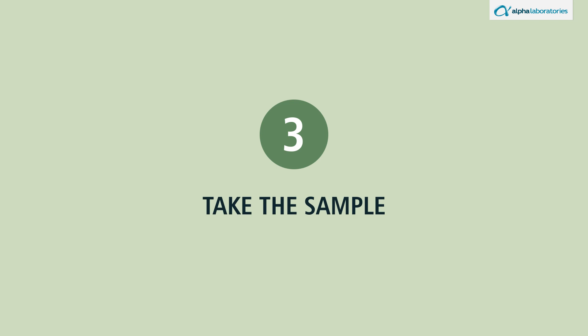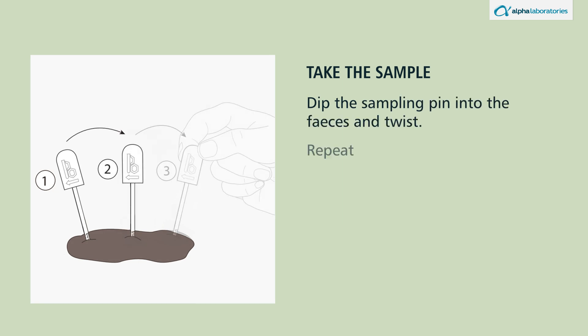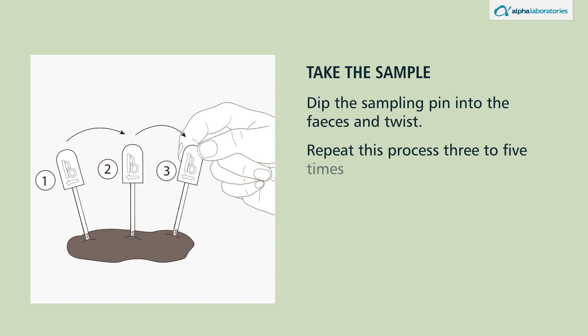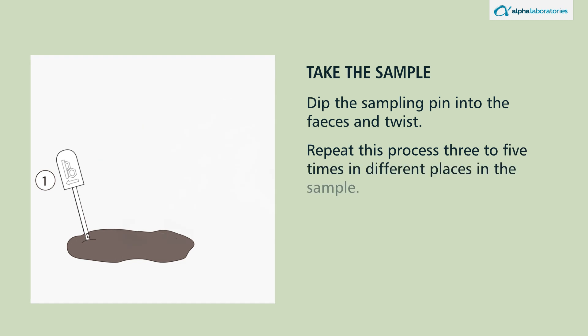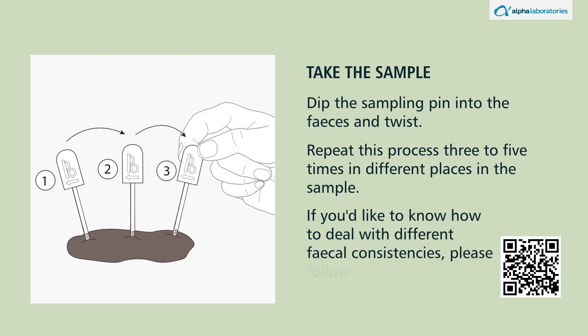Take the sample. Dip the sampling pin into the feces and twist. Repeat this process three to five times in different places in the sample. If you'd like to know how to deal with different fecal consistencies, please follow the QR code for more video instructions.